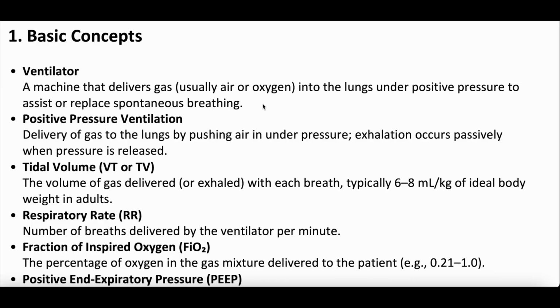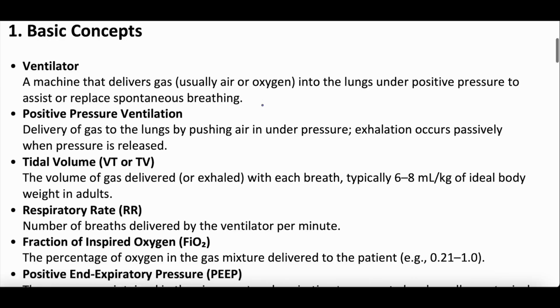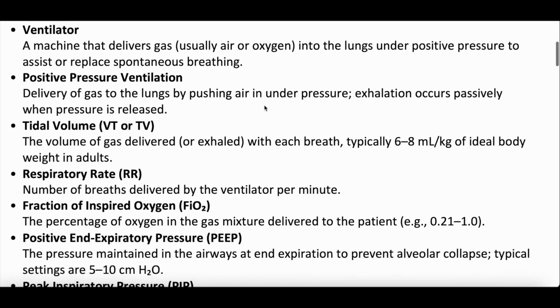Positive pressure ventilation is a concept where gas is being delivered to the lungs while under pressure. Okay, positive pressure ventilation. We're ventilating the lungs under pressure. This can be a BiPAP or CPAP mask. You have a sealed mask on the face that then provides gas to the lungs under a certain pressure.